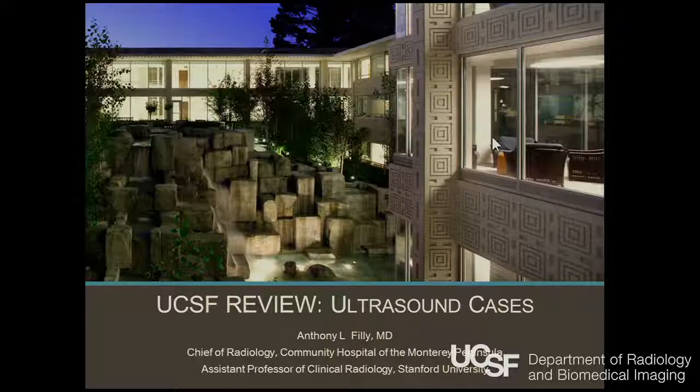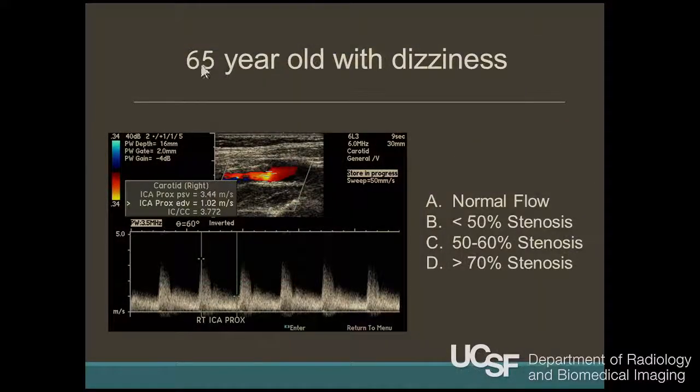I'm going to do a similar format, just some cases. There'll be a history here. I tried to add multiple choice questions this year, so if you are taking a test, you can prep for it in that way. This one's pretty basic, but shown for a specific reason. So it's a spectral Doppler study.